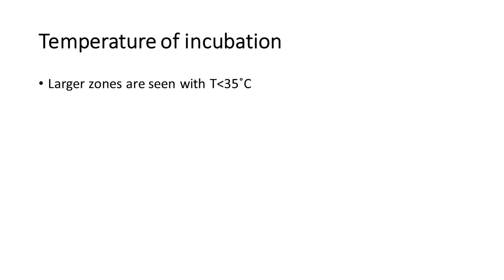Temperature of incubation. Normally the zone size depends on the temperature. We can see a larger zone size when the temperature is less than 35 Celsius.